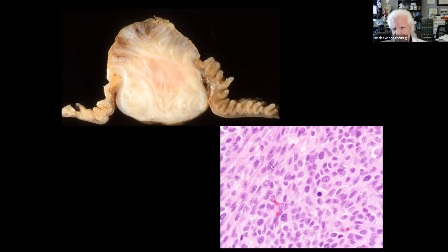The cells have variable size and shapes. Some are elongate like a hot dog. These are known as spindle cells. Others are large, polyhedral, and round, and these are known as epithelioid cells. I'm looking to see how aggressive these cells potentially are, and I'm trying to identify evidence of cell division. Now, I actually do literal counts of how many divisions are occurring in certain quantities of the tumor.